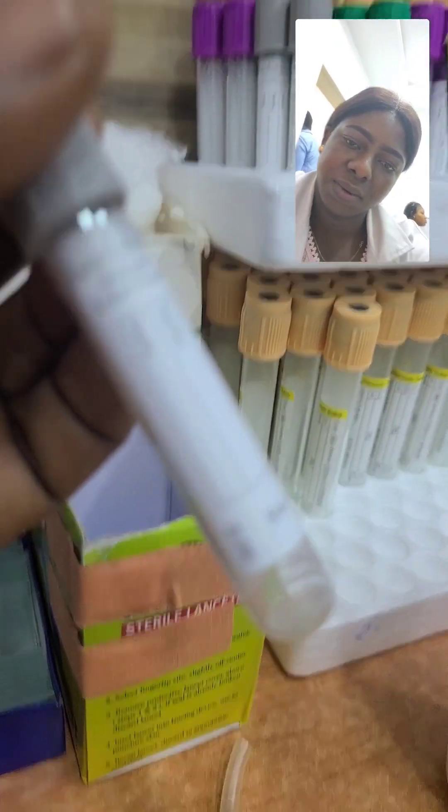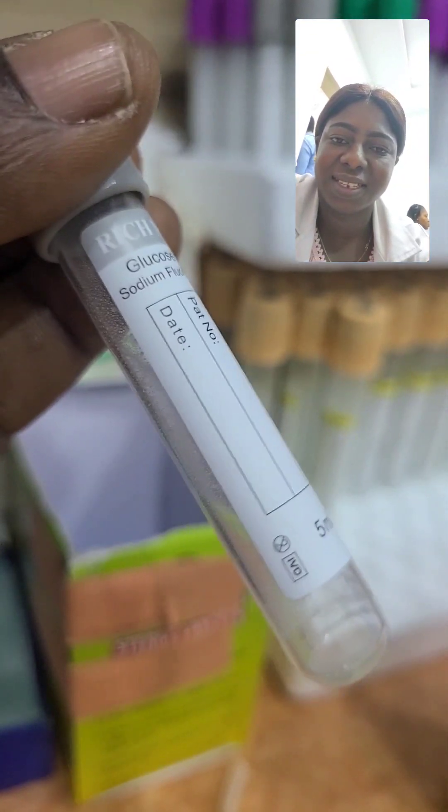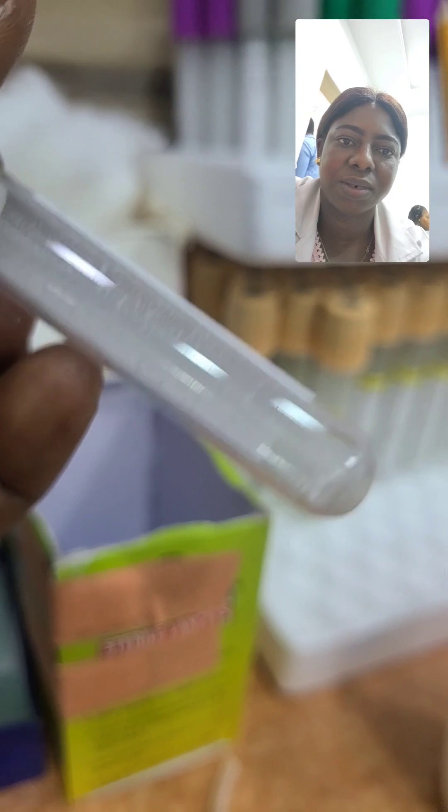This is a glucose tube. If you want to do glucose tests like fasting blood sugar, random blood sugar, or OGTT — oral glucose tolerance test — this is the bottle we use for that.